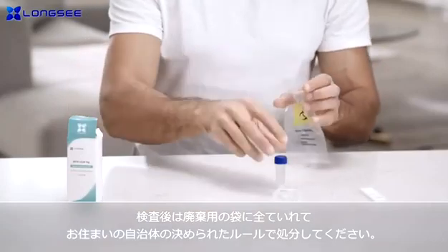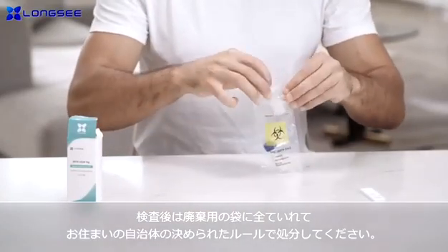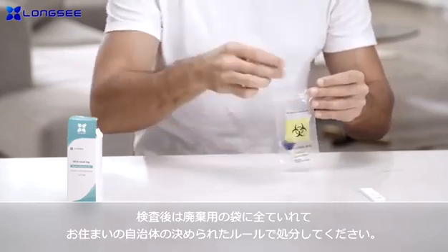After the test, place all kit components in the specimen bag provided. Dispose of the specimen bag in the medical waste bin.